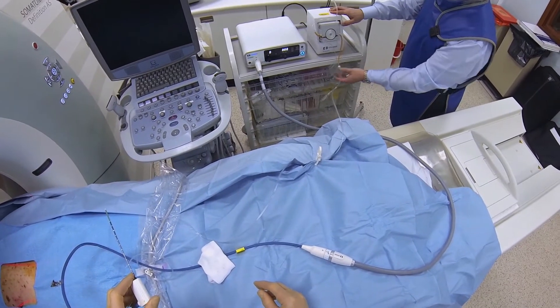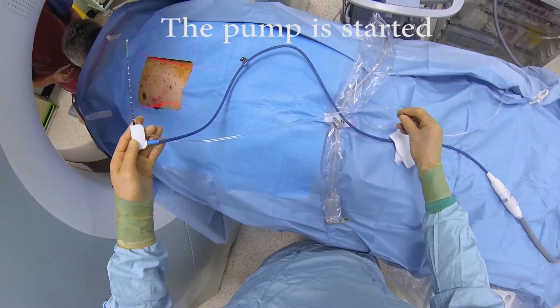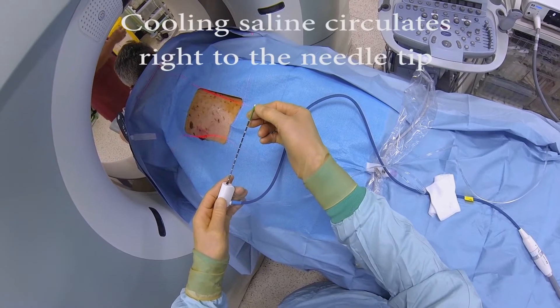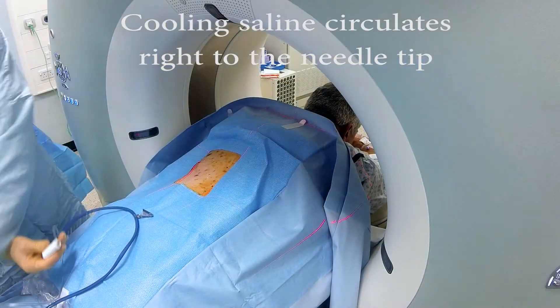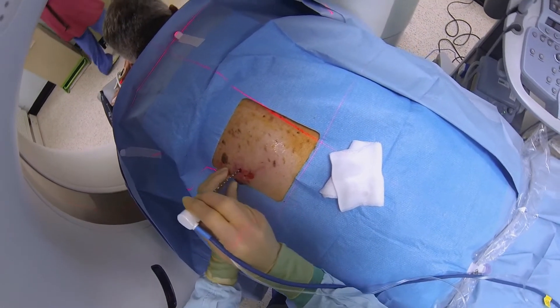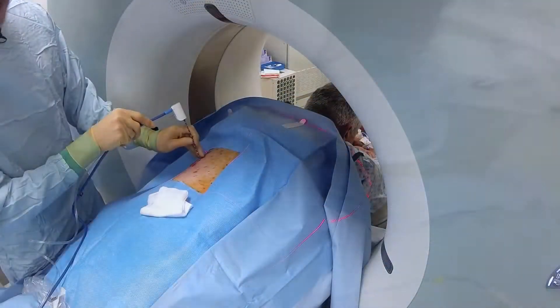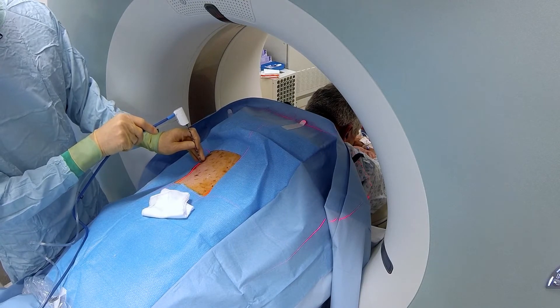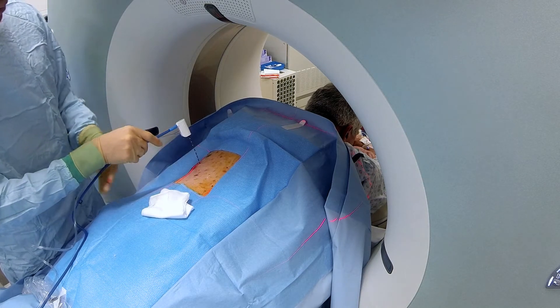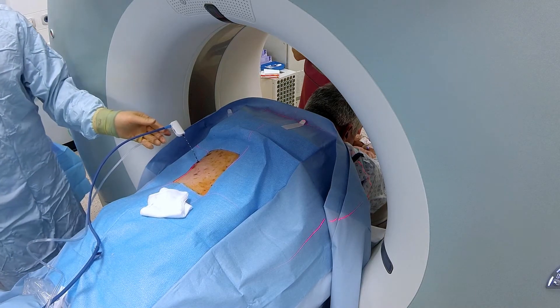So I can feel that coming through now. This is a closed circuit so it doesn't actually go into the patient, but it actually cools all the way to the very distal tip of the electrode. So you're just going to feel a little bit of pushing now. Just breathe in for me, breathe out, and stop breathing. Breathe away. Just carry on breathing gently — that's fine. Just a nice flexible needle.